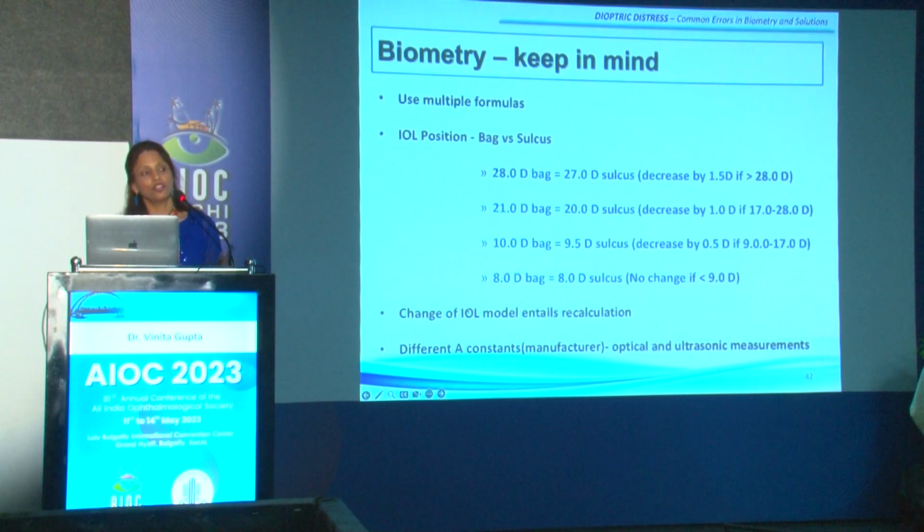And especially if you're changing your IOL model, again, you have to recalculate. You cannot use a different company's IOL with the same calculations and same power. Different A constants also need to be remembered, depending on whether you have done measurements with optical or ultrasonic biometry. If the IOL package doesn't provide that, ask the company person to give you that if you're using the same type of IOL for all your patients.